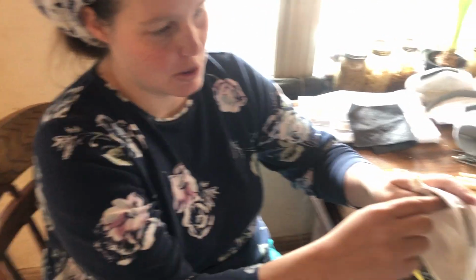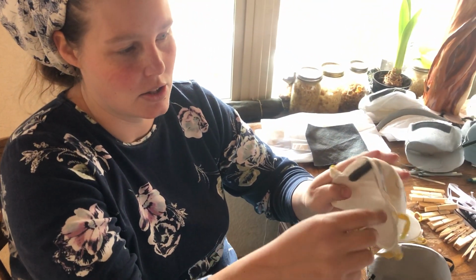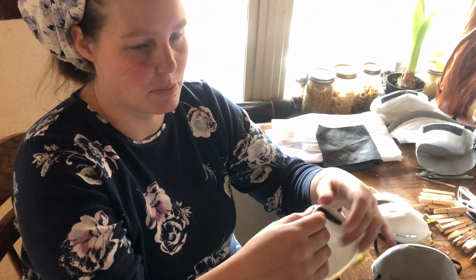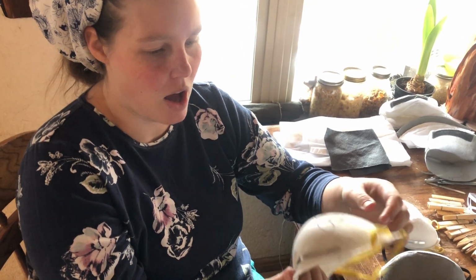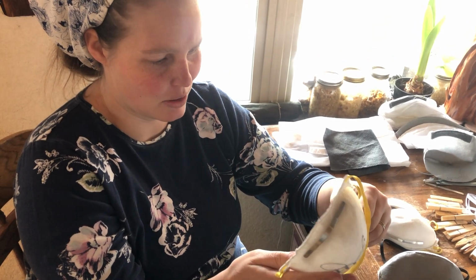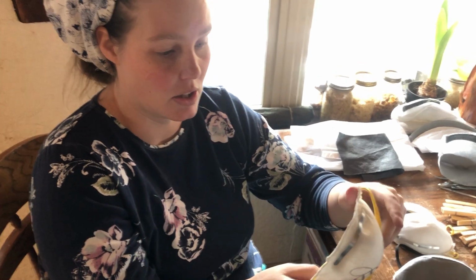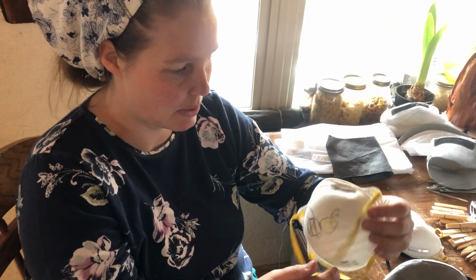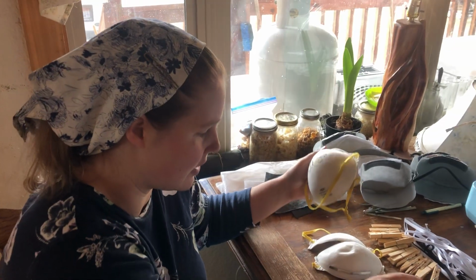It's got a comfort piece for your nose. It fits around your nose, and it doesn't let the air go up past your nose. And it has padding in here so that it doesn't hurt your nose, because the metal will eventually start really irritating you. So these things are hot and sweaty and uncomfortable. And yeah, we don't like putting them on, but you get in the insulation dust for about 30 minutes and you start coughing. And then you put your mask on and you can go all day and you aren't going to cough on that insulation dust, because these will keep it out. It can't get in around the sides.